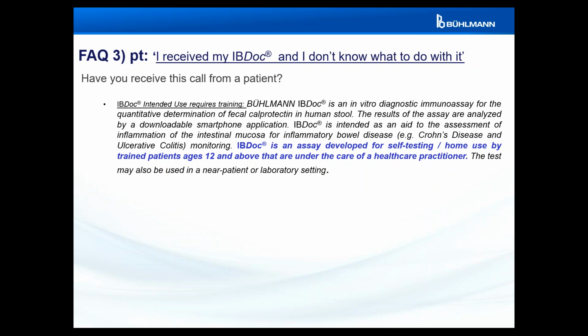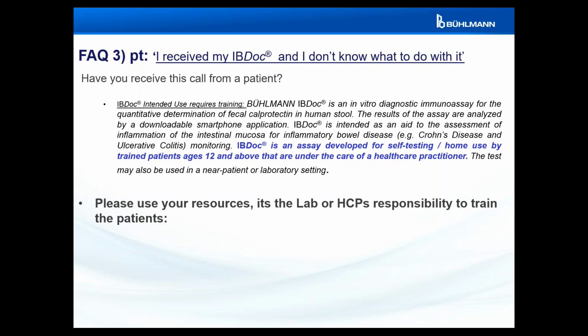So the key words there are trained patients. Trying to make sure the patients have training is important. I know there's a large variation with which clinical users do training, as you heard from Barb's clear perspective of how she trains her patients, as compared to Sam Alfassi from last year, who started doing that and then just started handing them the flyer and having them go to the website.